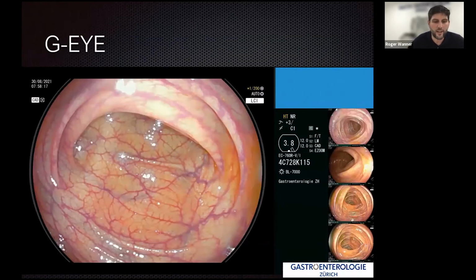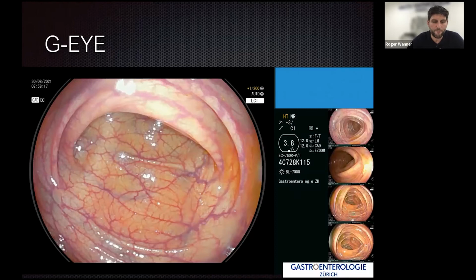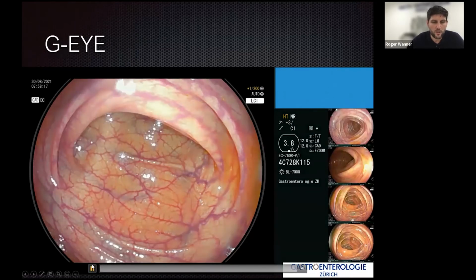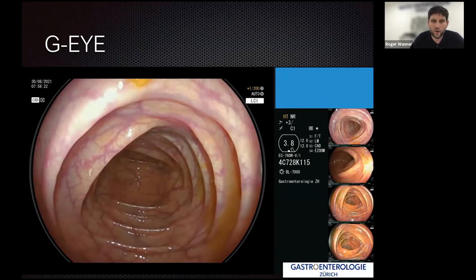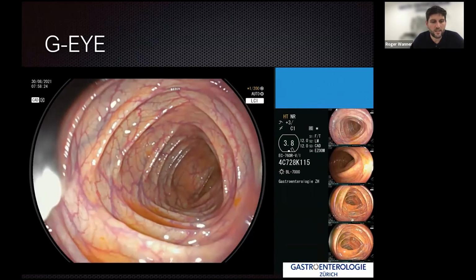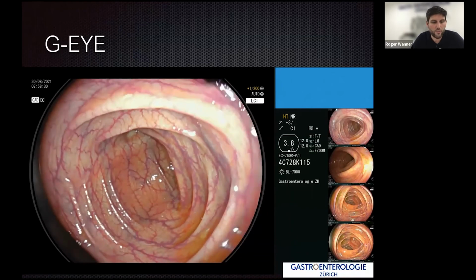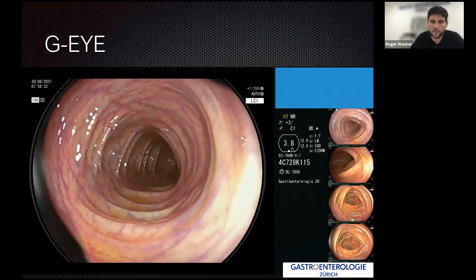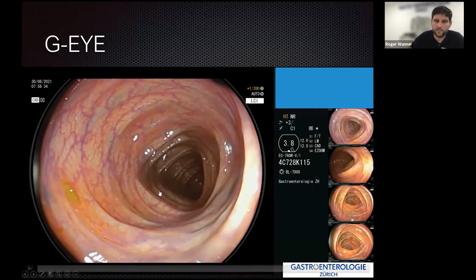Of course, during the endoscopy, you don't see the balloon, but of course you can feel it. The brilliant thing about the balloon is that it allows you to straighten any looping. As you can see on this video, you can retrieve and withdraw your endoscope. The maneuverability is not limited. As you can see on the video, you can push and pull the scope, and even rotations are possible. You also see how the folds are flattened, and the visibility of the mucosa is excellent.